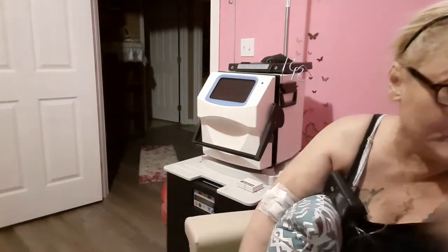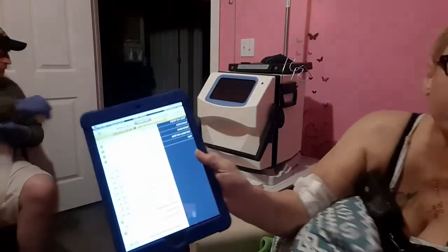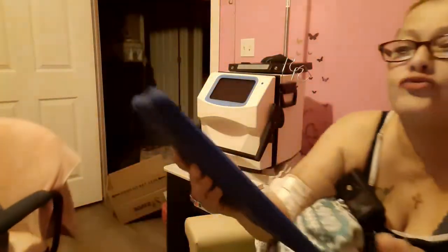Anyway, good people, now my job is to chart my treatment. And treatment charting includes a sitting blood pressure and pulse, standing blood pressure and pulse, my temperature, and then my post-treatment weight to see just how much it affected my dry weight. A lot of times I go below my dry weight, which pretty much means blood pressure is good and stuff like that.